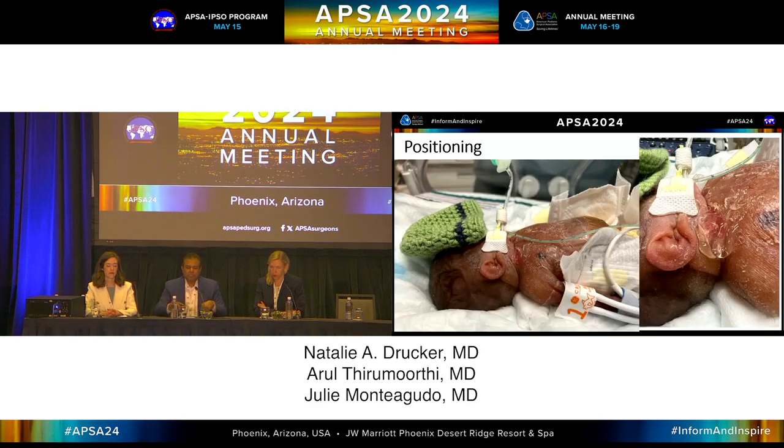So positioning, it's standard, small roll, bump. I think I rolled up a Curlex or something to make this here. And this is just one that we did about 2 months ago. Expose the right neck. You can see a little bit of gel left there on the neck.